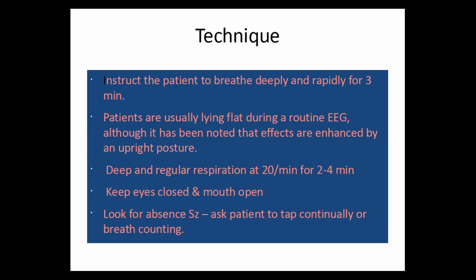It's not like that. It will be 20 per minute, like this. So it will be only 20 per minute for around 3 minutes. And keep the eyes closed and the mouth open. The patient, in addition, should be tapping continuously with his hand, or we can count the breath.